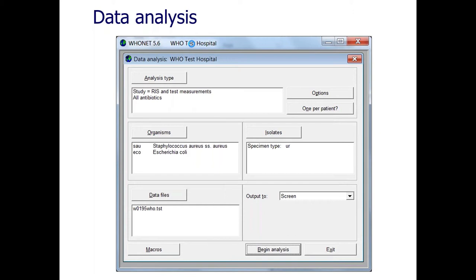There are two ways of running analyses. One is through the normal data analysis module where you interactively work with the database — you try different organisms, specimen types, and do the analyses you want. The second way is called quick analysis, where you batch things together. If you do the same analyses every Monday or every quarter, you can just hit a button and have Hoonet run a series of 5, 20, or 40 analyses one after the next. In Hoonet we call this quick analysis, and it takes advantage of Hoonet's macro features, which can be combined into reports.